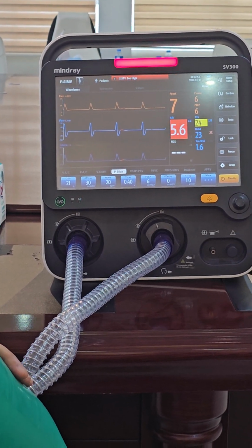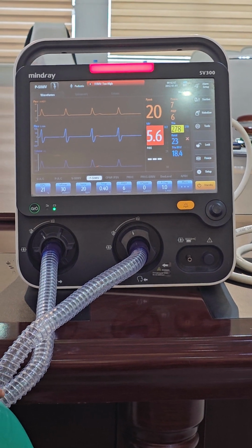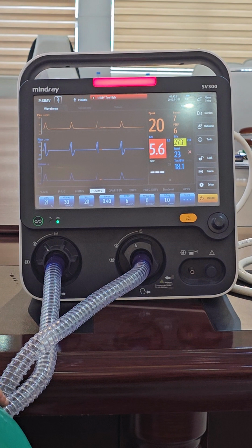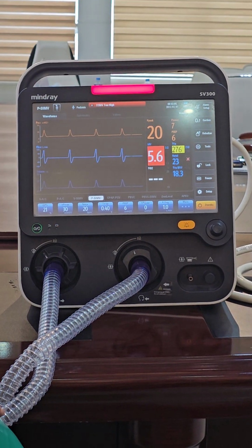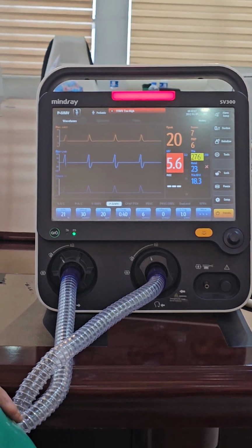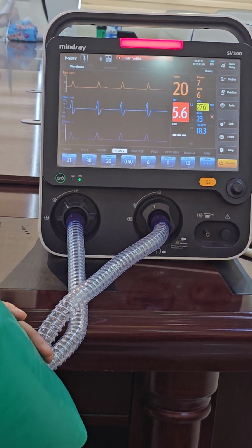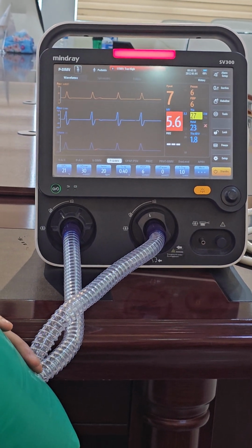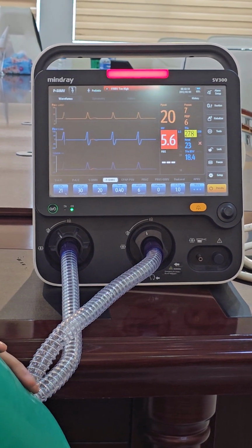It should be without sedation. One. Second, if the patient gets tired, let's say you are a driver and he drove for 24 hours, will he be able to drive? No. So when the patient is sick, we cannot give PSV, like a premature baby. But we can give it for 24 hours, whatever the driver can tolerate, and then he will get tired. So that's the PSV. First, the patient should be not tired. Second, should be not sedated.